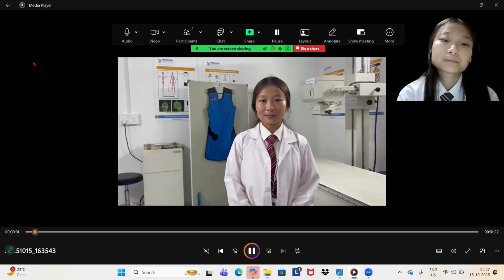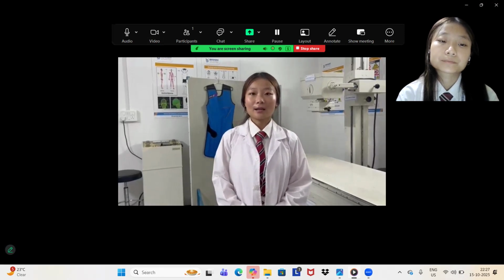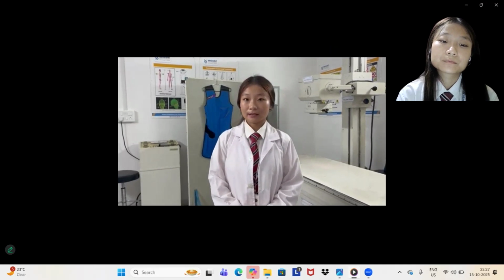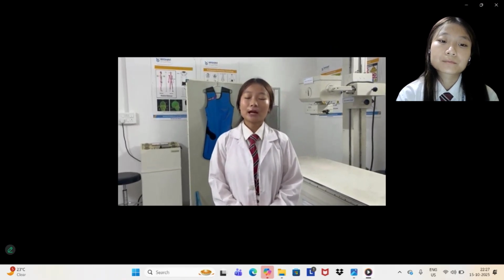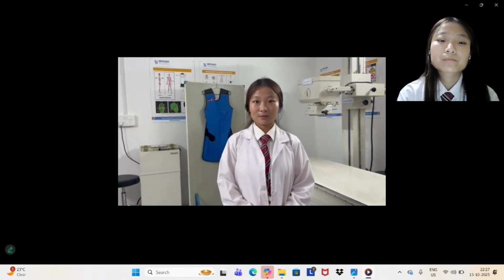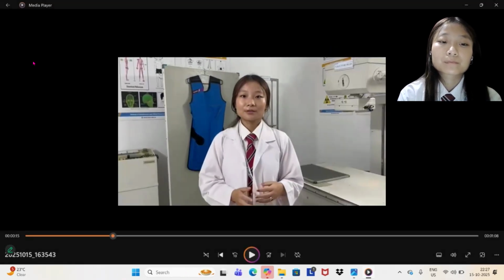Good morning everyone, my name is Prerna and today I am presenting a lab demonstration on foreign object detected on body. In this video, I will explain how X-ray helps detecting foreign object in body.